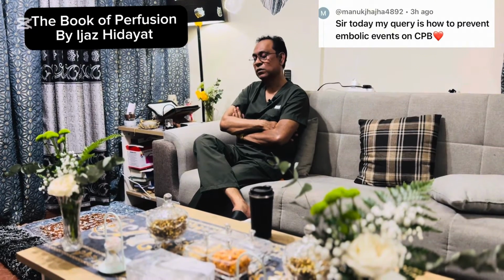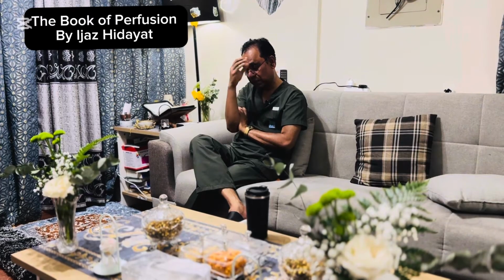Number three is your oxygenator. In an oxygenator you have filters, and bubbles in smaller amounts can be detected and stuck in the membrane, where you can remove the air through the recirc line. Inform your surgeon and your cardiac anesthetist, clamp your venous line, clamp your arterial line, open your recirc line, and run your pump for 1 to 2 liters. Try to tap it and remove the air present in the circuit. So these are the pre-air embolism safety measures which you have to take as a perfusionist.